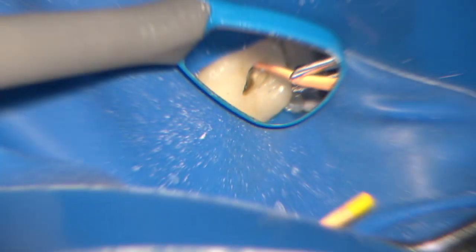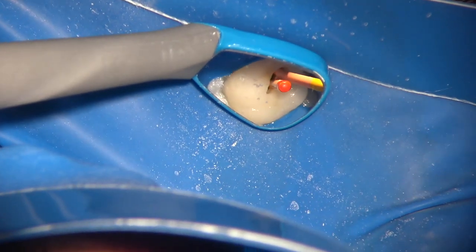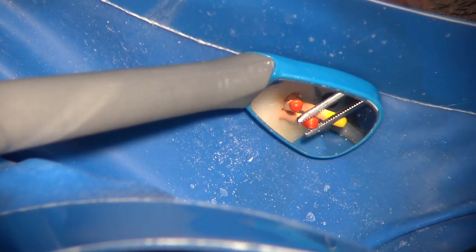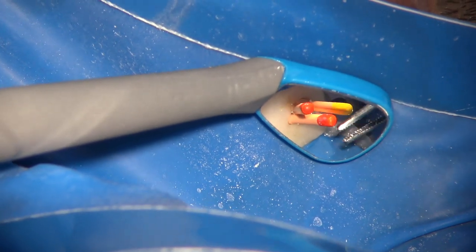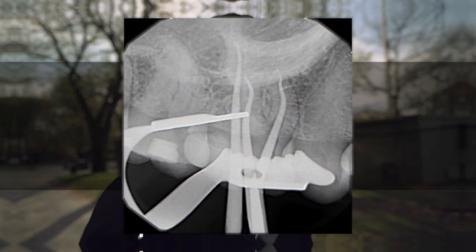Back to April 14th: once that was done, I managed to get into a little additional area on the mesial buccal canal. I was ready to dry the canals, and after drying I couldn't see any more drainage, so I decided to complete the case in one visit using BC high flow, placed with the mineral trioxide aggregate tips. Fitted cones with a radiograph confirmed they were exactly where I wanted them to be, so they were coated, seated, and filled.